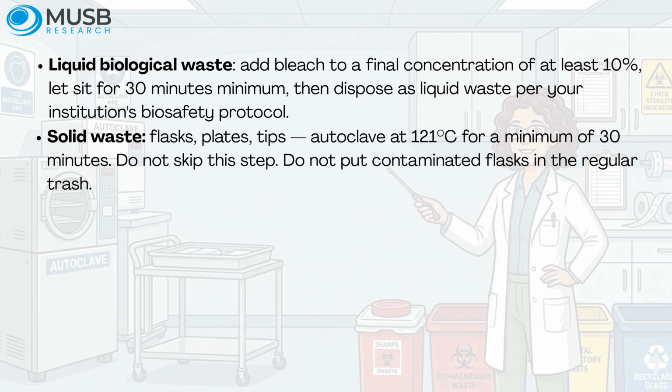Solid waste. Flasks, plates, tips, autoclave at 121 degrees Celsius for a minimum of 30 minutes. Do not skip this step. Do not put contaminated flasks in the regular trash.